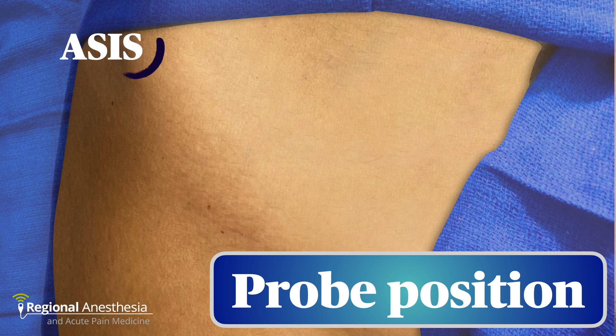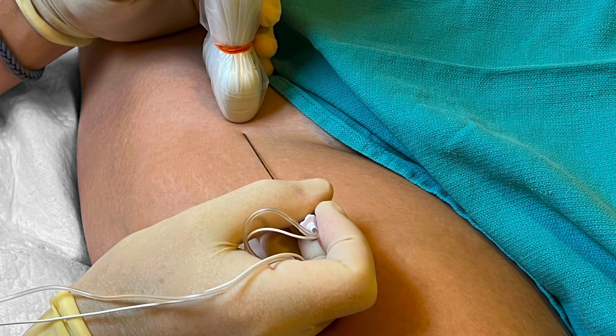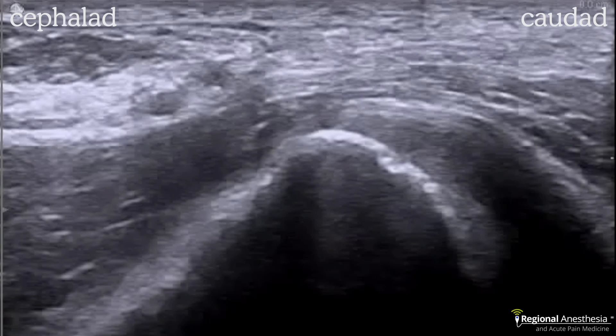With the patient supine, the anterior superior iliac spine is palpated. A linear transducer is placed in the parasagittal orientation just medial to the ASIS, then translated a few centimeters caudally until the brim of the pelvis is seen — this should put the probe squarely over the inguinal ligament as well. A needle is then advanced in-plane from the inferior aspect, aiming to pop through the fascia iliaca north of the inguinal ligament. One important landmark is the deep circumflex iliac artery, which runs laterally from the femoral on top of the fascia iliaca, serving as a good landmark for confirming correct plane placement.